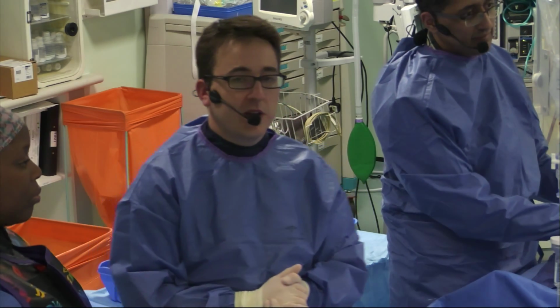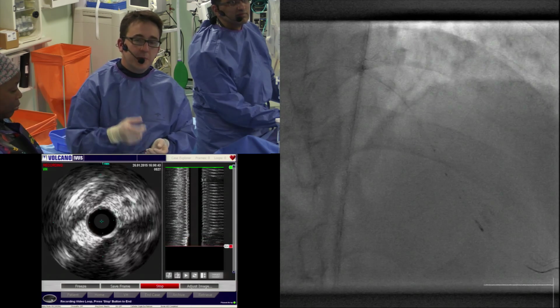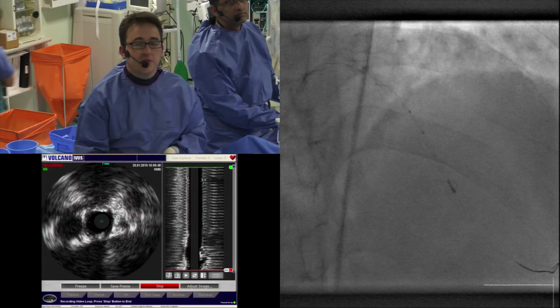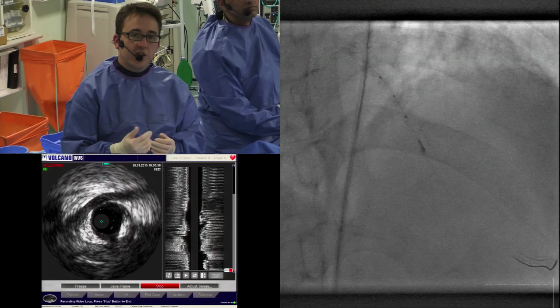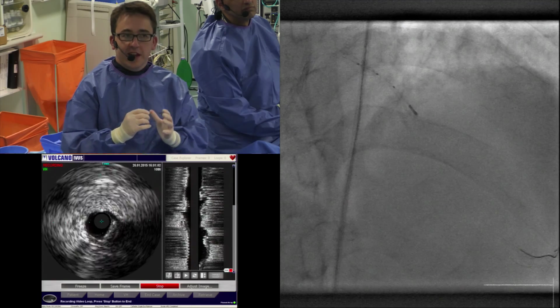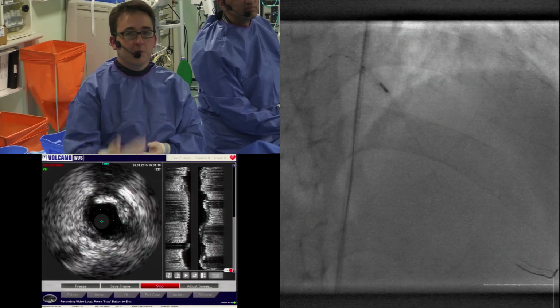Perhaps we could just see the IVUS image as well in a small box. That'd be great while we're discussing. So how long do we wait when we're giving nitrates? Well, essentially we give the nitrates, and we wait typically for about 20 seconds. The first thing which happens when you administer nitrates is you get a mild hyperemia. Same as when you give contrast, same as when you give heparin, anything down the vessel. This lasts 20 seconds. Then after you administer the nitrates you get an epicardial vasodilatation effect. The knock-on effect is to make the vessel bigger, and effectively the IFR or FFR value will climb, so it will become more normal.